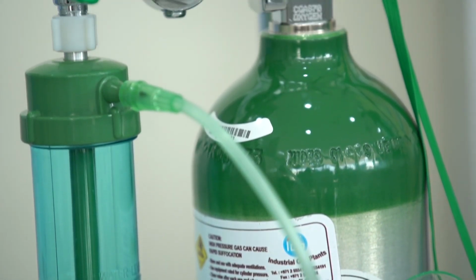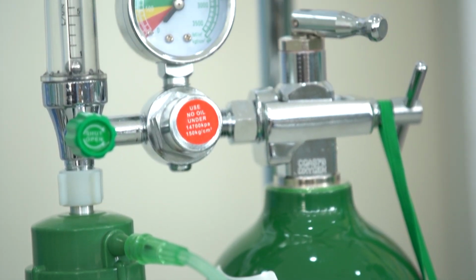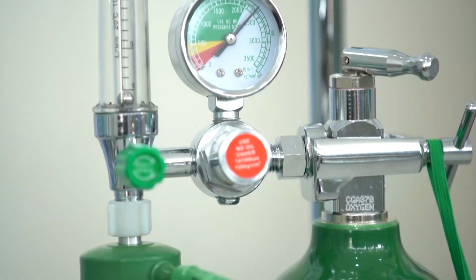Therefore, we should be very careful about the type of regulators and the type of flow, how much we are providing, because today in history a coronavirus patient needs more oxygen. Therefore, we are starting from 1 liter to about 90 liters of flow we have to give to the patient.